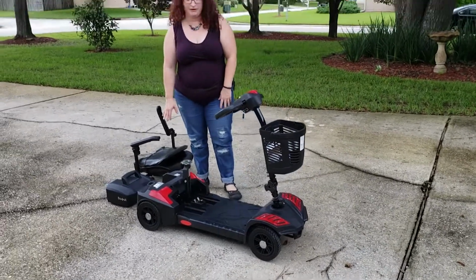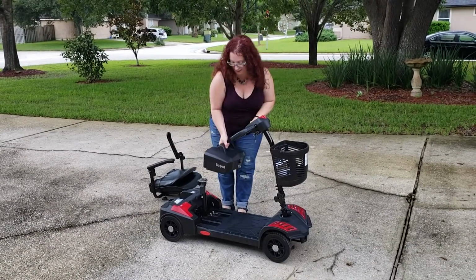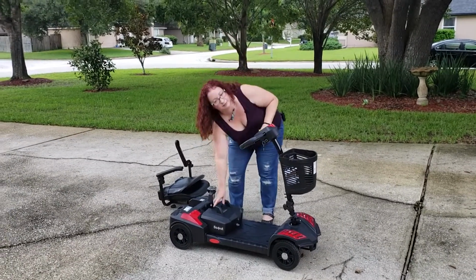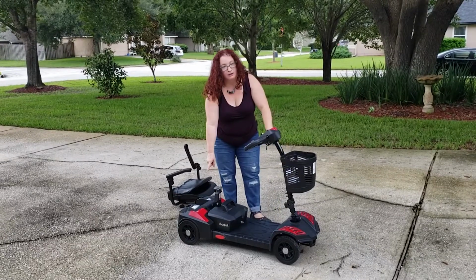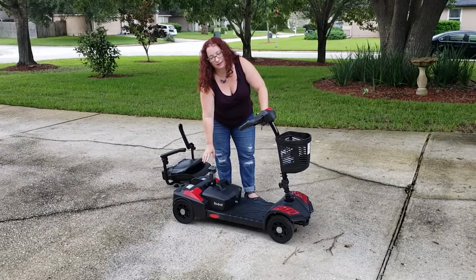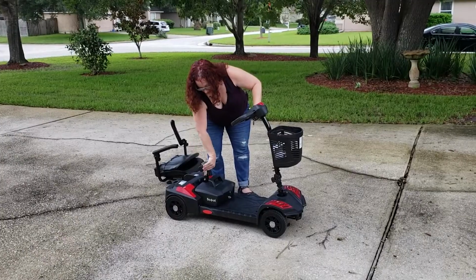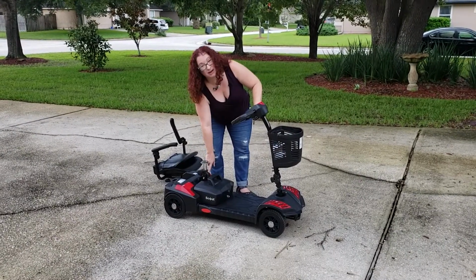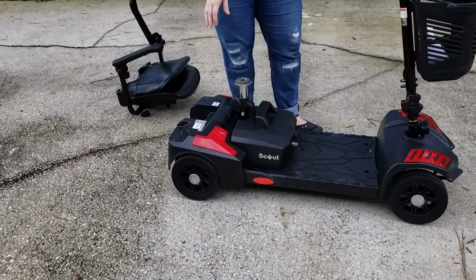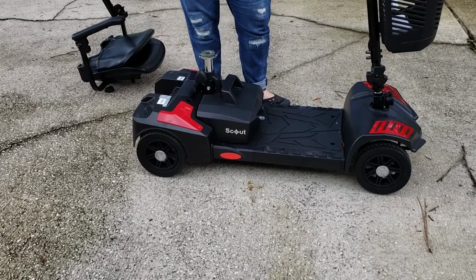The next thing I'll do is put the battery back on. It's as easy as lifting it up, putting it back down into place. Just make sure it's locked in place and it's not sliding around. If you put the battery lock bar back in place, on this model there's a battery lock. Not every model has that, but it's just this lever here, and you can slide it down the post so it rests on top of the battery pack, and then tighten it up. That's there so that if you're going over bumps or anything, that the battery doesn't lose connection with the scooter.